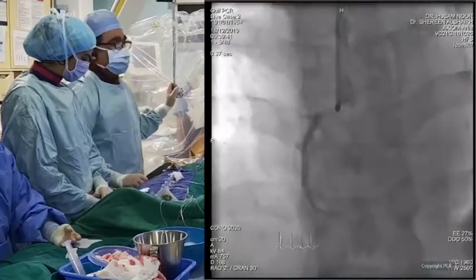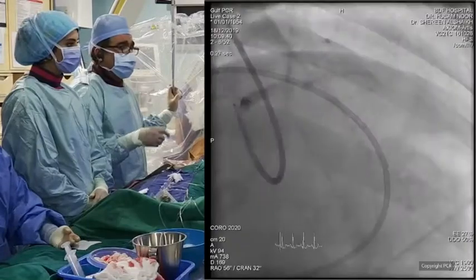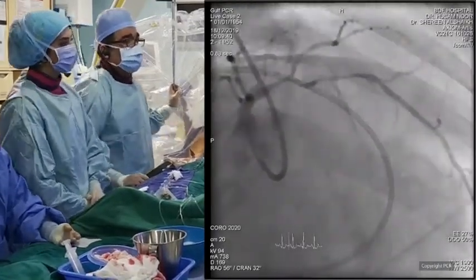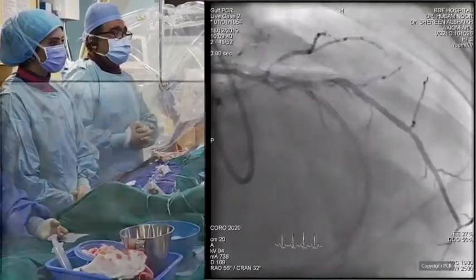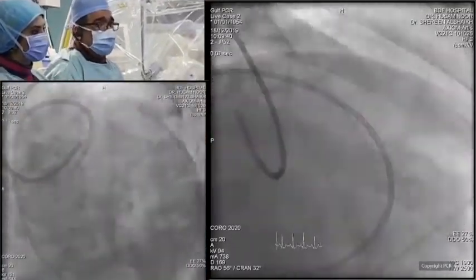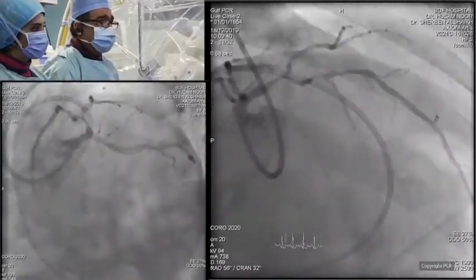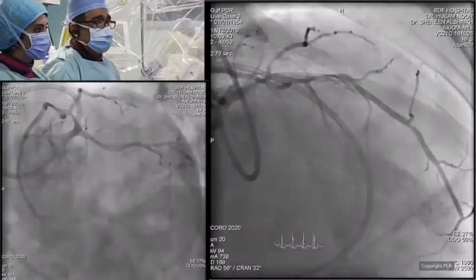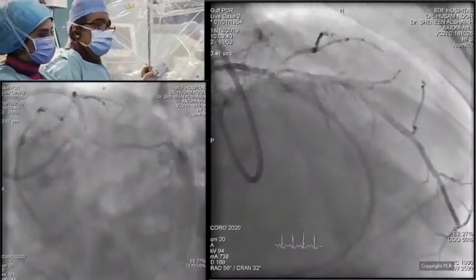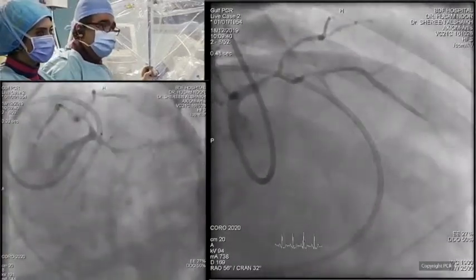Just carry on. So we're done with the right heart study, and we're going to show you the angiogram of the left coronary system. As described by Dr. Fajadeh earlier, we talked about the bifurcation and the length and so on. I don't know if you can appreciate some calcium that you can see, but it's different than the calcium, for example, of the case that we did earlier this morning. The presentation is also different. He presented with ACS with biphasic changes in the LAD.